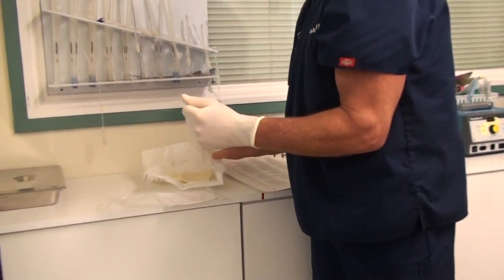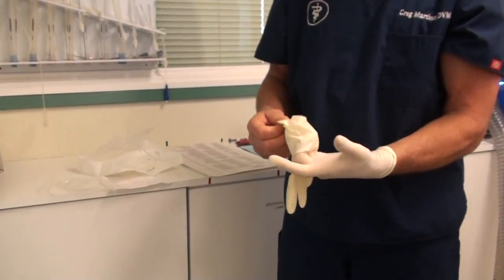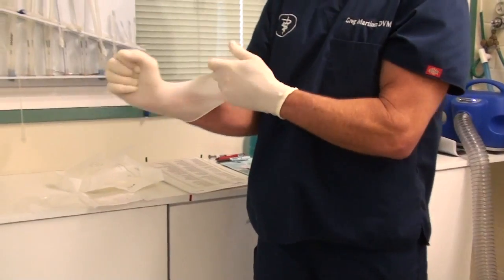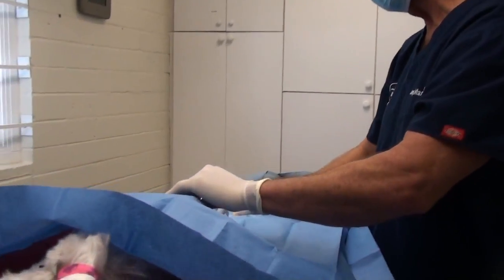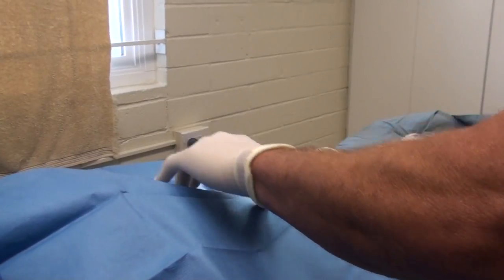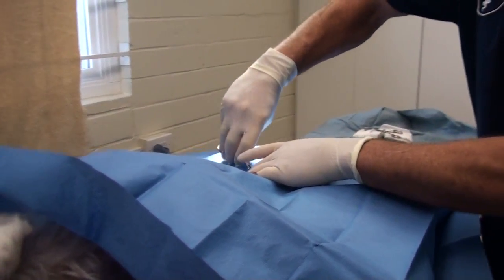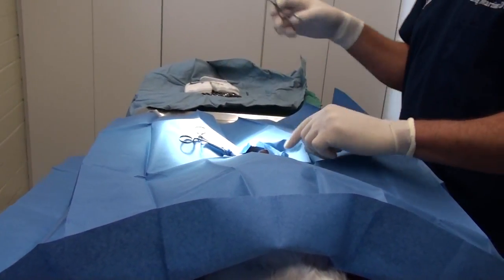Sometimes I gown, but this is actually a pretty exterior procedure and won't need a gown for this one. With this hand I can touch anything — it's sterile. We're going to put the drape on where we're going to do our incision, and we'll be putting a catheter in the penis to figure out where we're going to cut. We're going to put the towel clamps on to keep the drape in the right place.